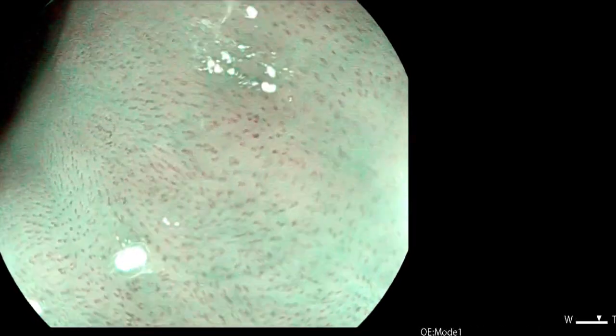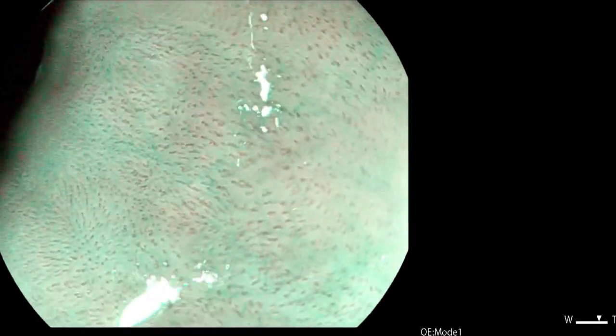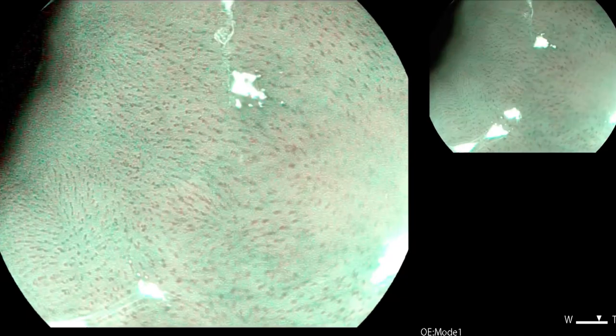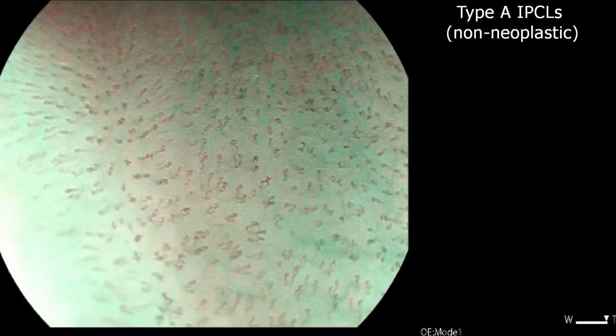With the use of magnification and Optical Enhancement Mode 1, the IPCLs can be characterized. Here we see a normal loop structure — non-dilated and slightly elongated IPCLs — indicating non-neoplastic squamous mucosa.